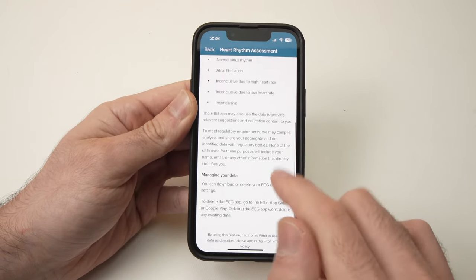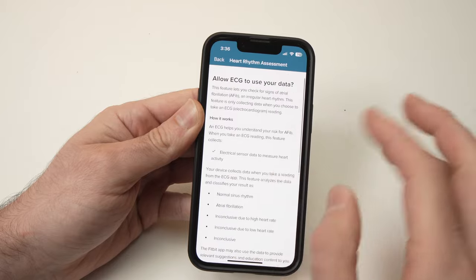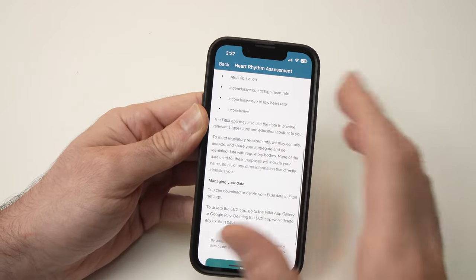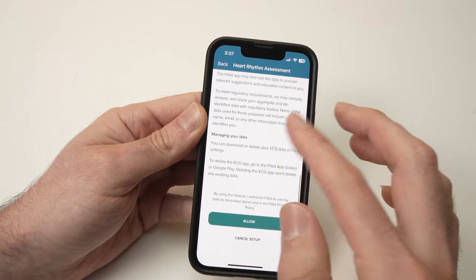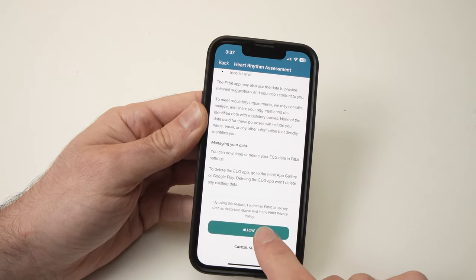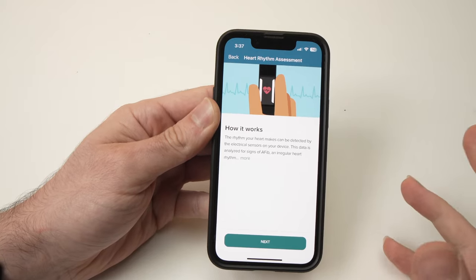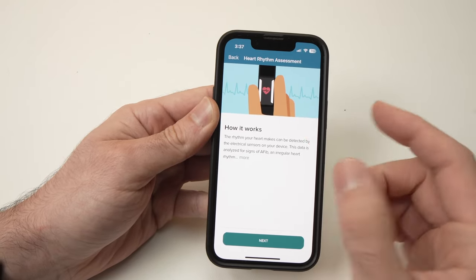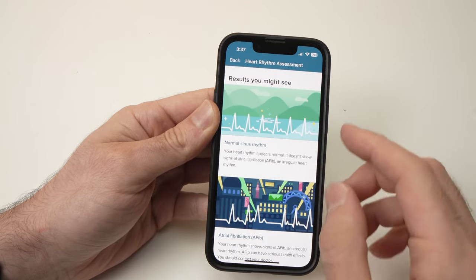Go down — I suggest you read the information here. You need to read it and then press Allow, otherwise it won't work. It will then tell you how it works and how to position your fingers, which I'll also show you in a few seconds.